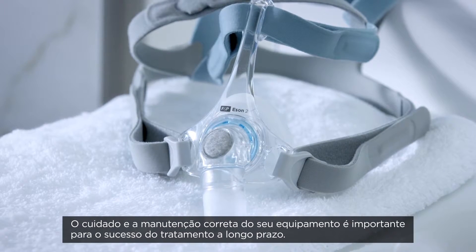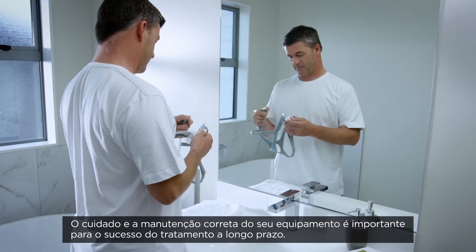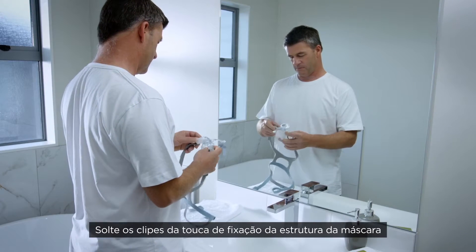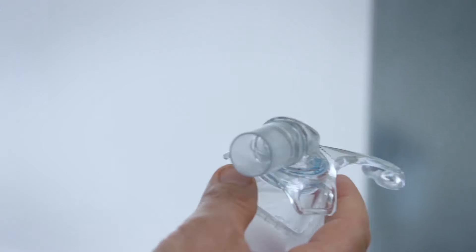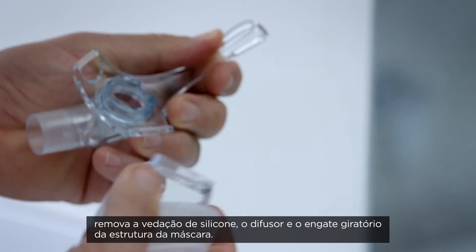The correct care and maintenance of your equipment is important for long-term therapy success. To disassemble your mask for cleaning, unhook the headgear clips from the mask frame. Remove the silicone seal, diffuser, and the swivel from the mask frame.